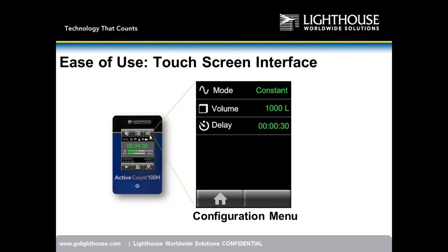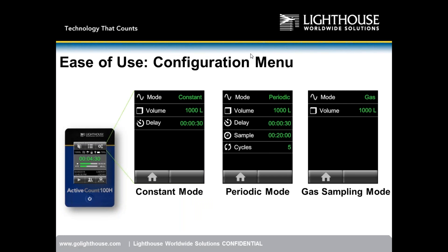The configuration menu has three sampling modes: constant, periodic, and gas sampling. You can program a specific sample volume and set a delay time — just like a particle counter, so you can walk away from the sample without contaminating it yourself.